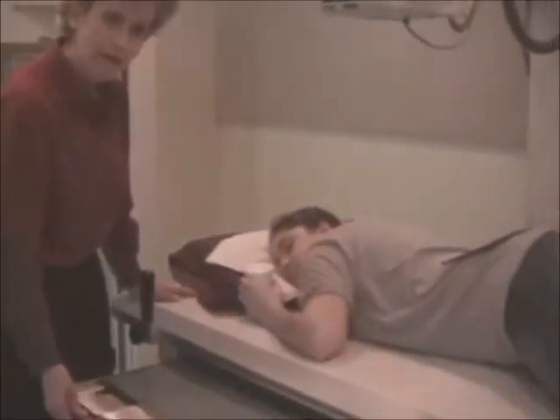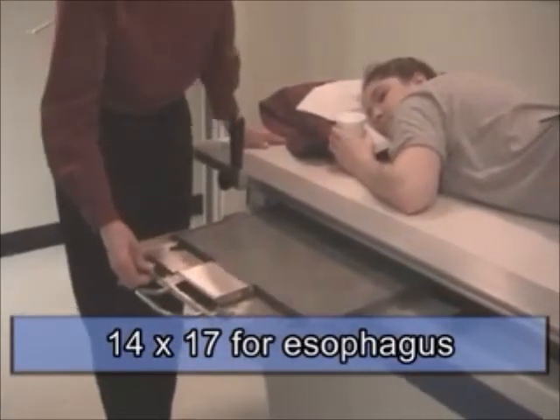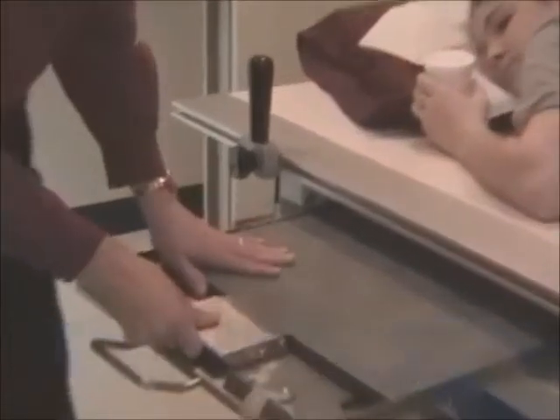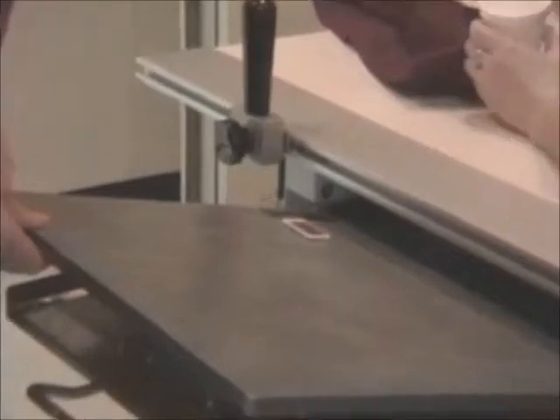But let's take a look at our patient here. For an esophagus, we generally use a 14 by 17 film. I have the ID to the top, and the right marker is moved in a ways because I will be showing collimation on the two sides.